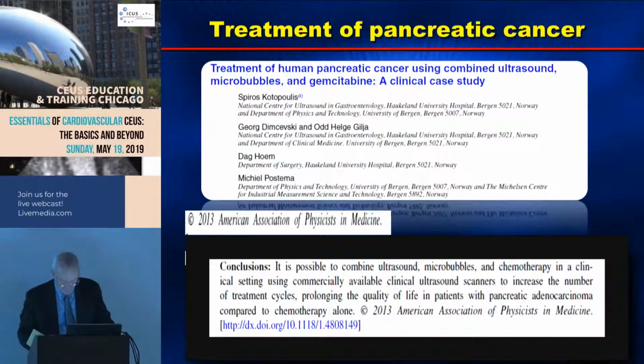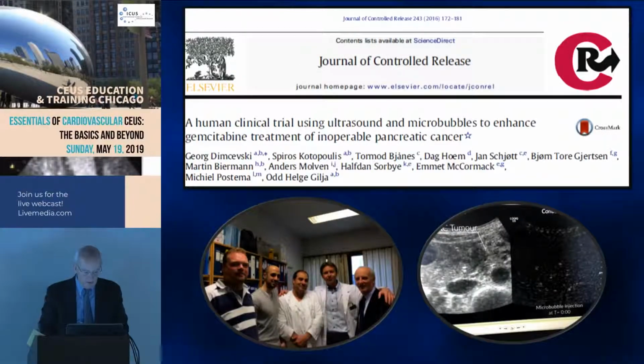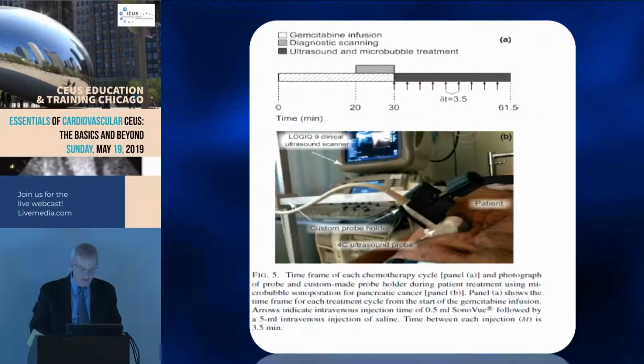So what they did, and I'll put the next slide up. This is the group, by the way, and there's their paper. It was not published in a clinical journal. Nobody knows about this. They took a probe and took a sort of a mechanical device and fixed it to the belly of the patient because they wanted it held there for 61 minutes.